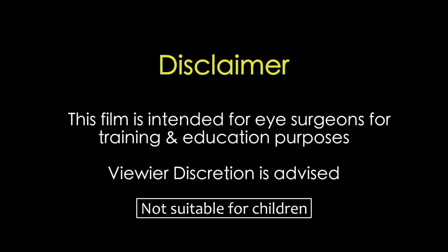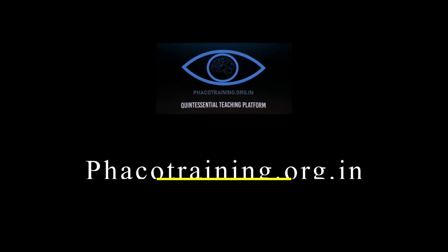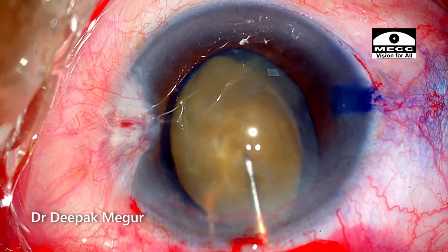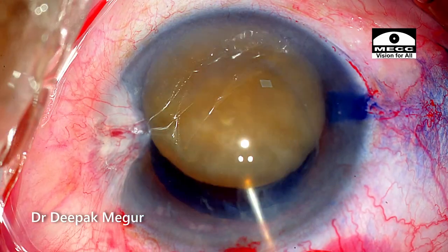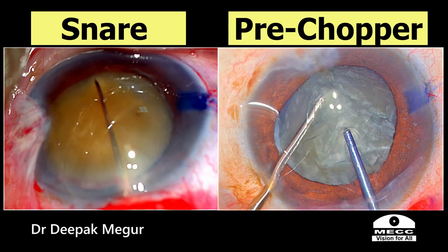This film is intended for eye surgeons for training and education purposes. Viewer discretion is strongly recommended. Hi, this is Dr. Deepak Meghor and today I'll be demonstrating the use of a snare for nucleus bisection in manual small incision cataract surgery.